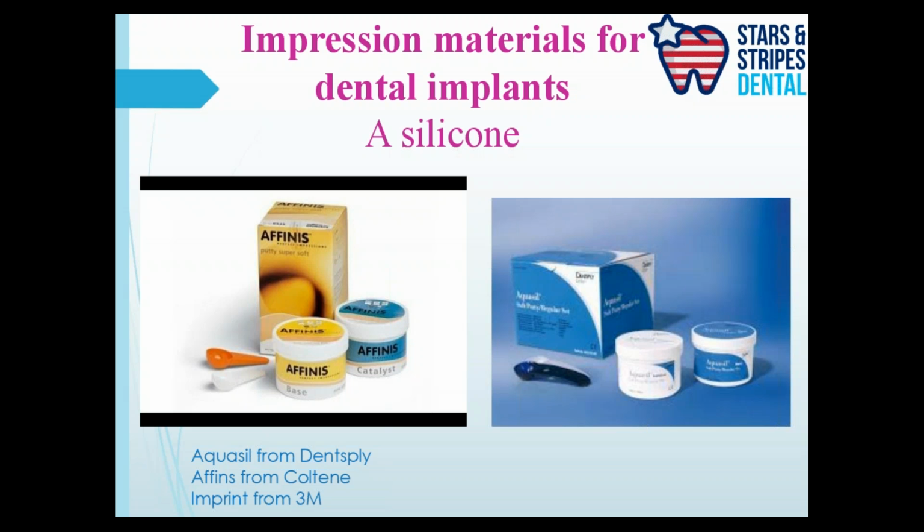When we're talking about the A silicones, Dentsply has something called Aquasil, which is a putty as well as light body material combination. Coltene has their product called Affinis, and 3M has their product called Imprint. So all of them are good materials. It's your choice.